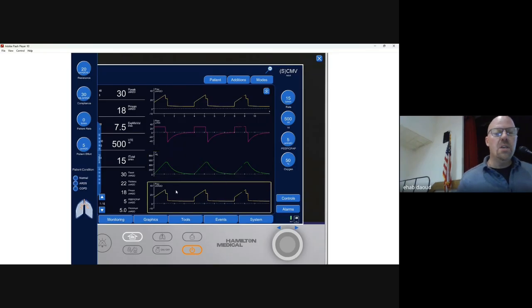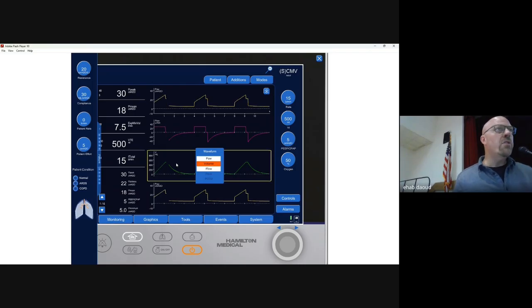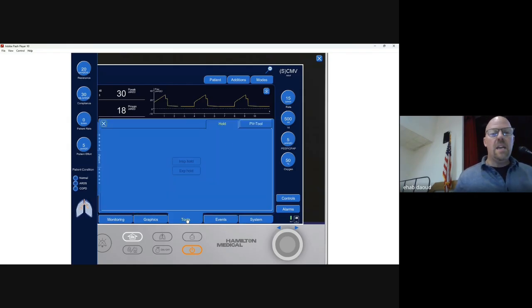And in this situation, you can click on each of these scalar wave patterns and you can change the screen to what you want to see. And then the newer simulators, you have the ability for the intelligent panels to pop up. So complete configurability associated with this in the passive patient. So we're going to move on and look at some of the advanced mechanics.